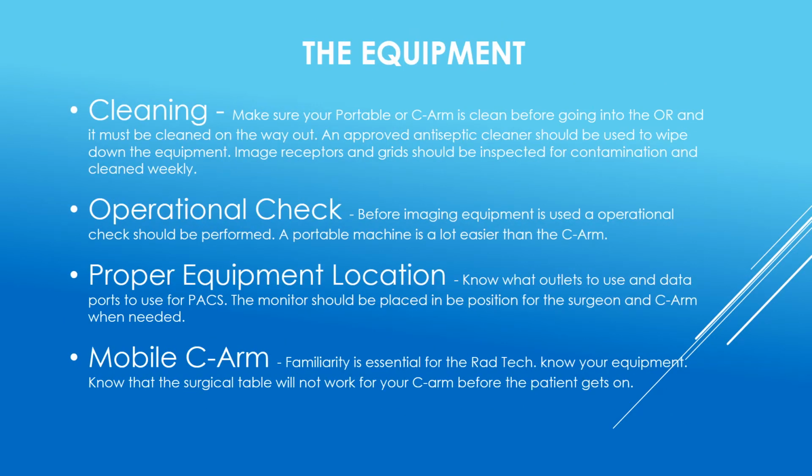The equipment. Cleaning. Make sure your portable or C-arm is clean before going into the OR, and it must be cleaned on the way out. An approved antiseptic cleaner should be used to wipe down the equipment. Image receptors and grids should be inspected for contamination and cleaned weekly.